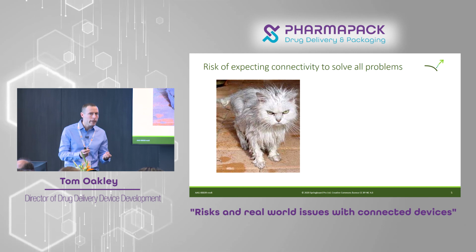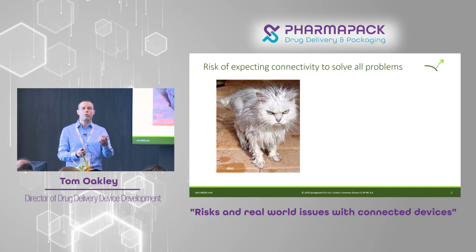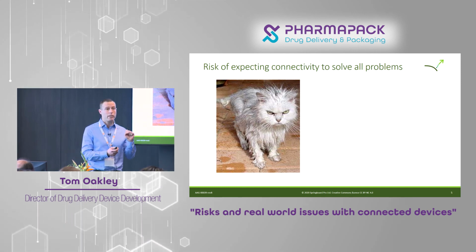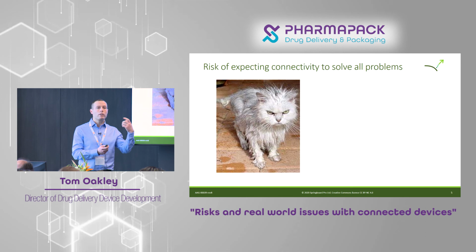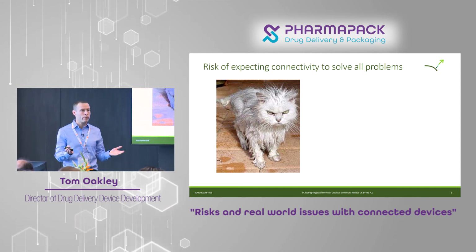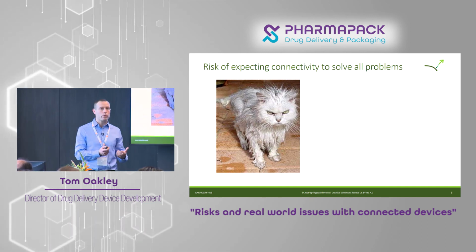Not necessarily. Some connected devices will register that someone is or is not pressing the inhaler. In this case, that wouldn't have helped. She did press the inhaler. If she had not gone back to the doctor, no one would have any idea that she was not being adherent. But there are devices that are connected which could have supported this.